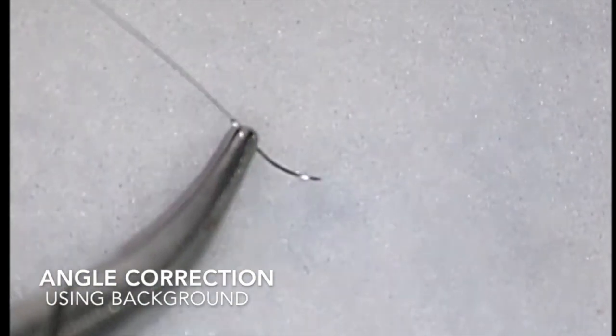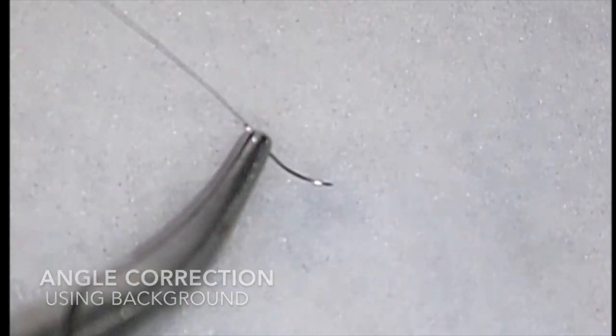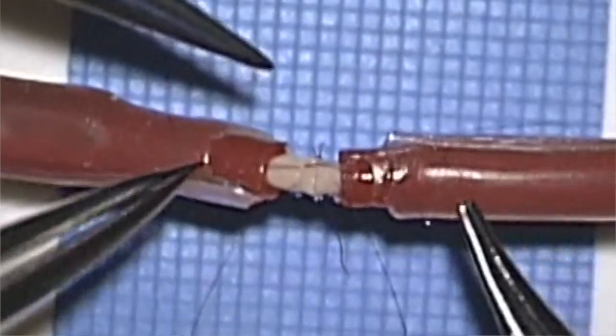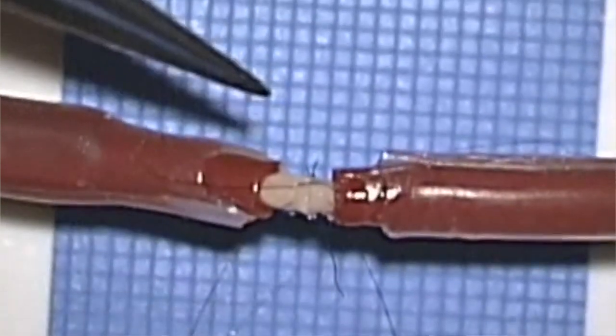We went from a 12 o'clock position to 6 o'clock on the front, and then flip the vessels over. And as we said, there's a pretty good vessel match, mismatch was limited, so we could just go straight without having to compensate for that mismatch very early on. You got your first stitch in, lovely, not down all the way, no space to be seen, and the second throw, third throw, all the way down, flattening the knot, and how we can go in the opposite direction to get the knot flat without having to swap hands.